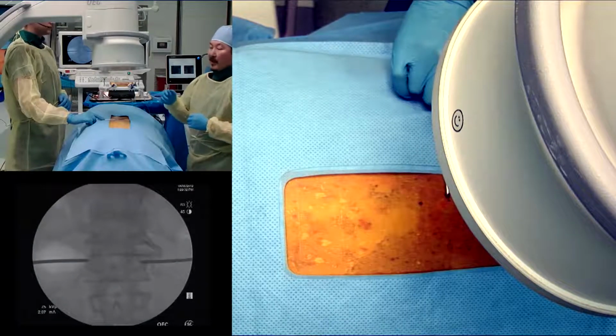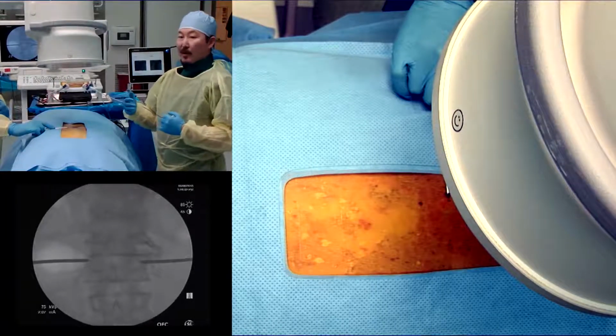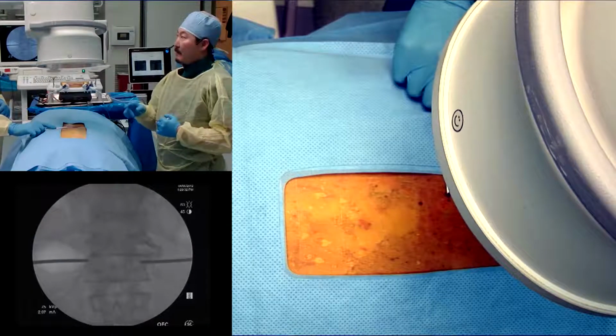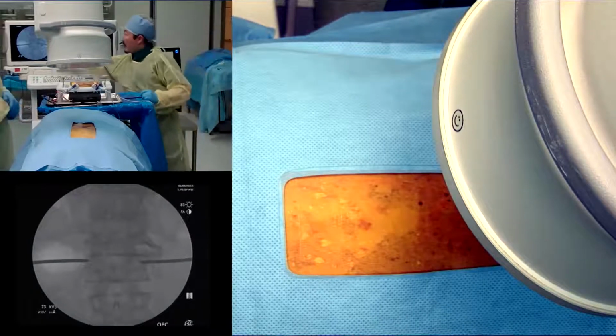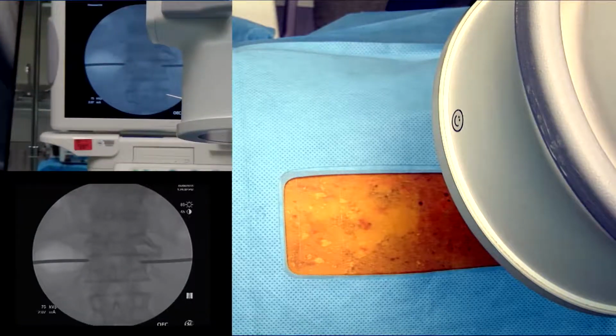So typically, when we do kyphoplasties, vertebroplasties, and even percutaneous guide wires in the lumbar spine, when we take a look at the pedicular shadows, I don't know if you guys can see this or not, but right over here, this is the lumbar spine.